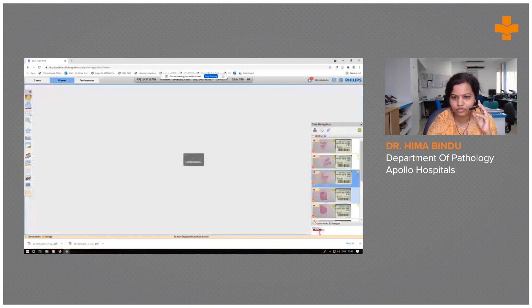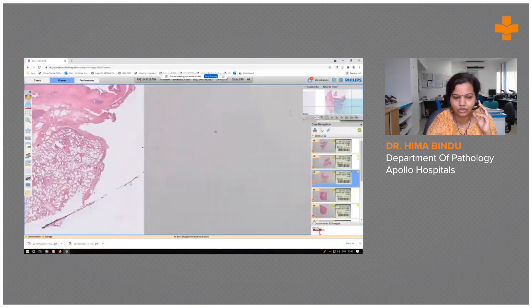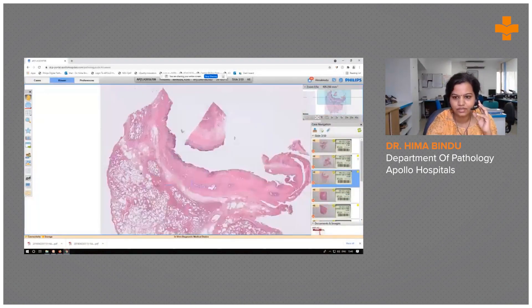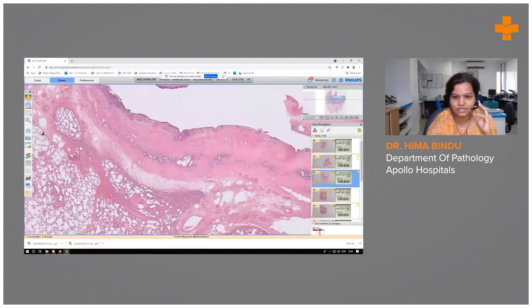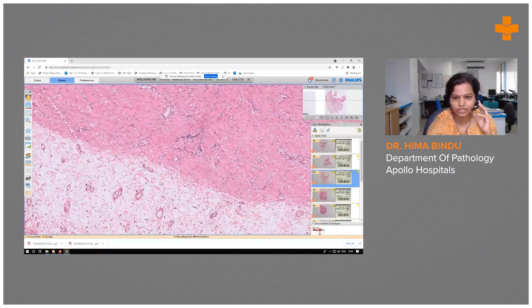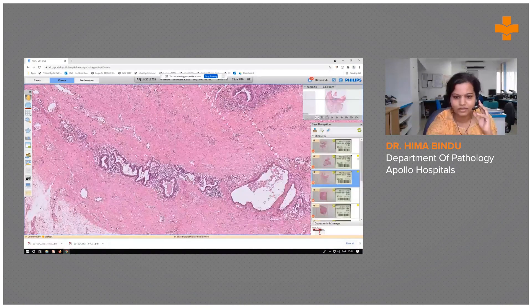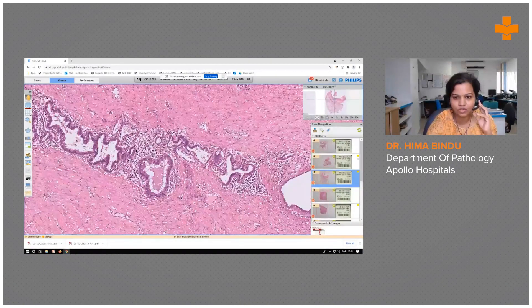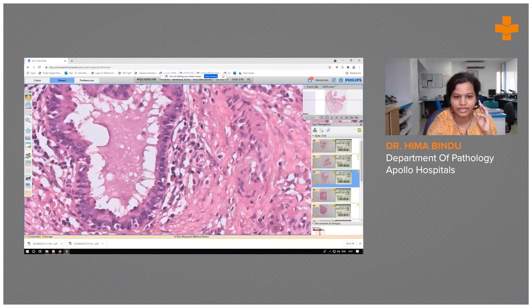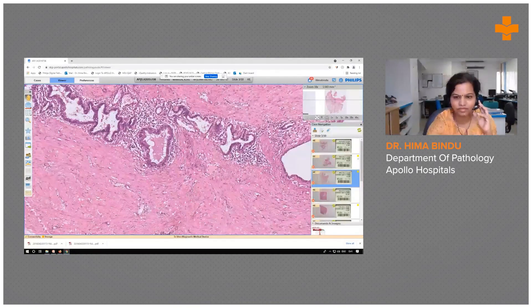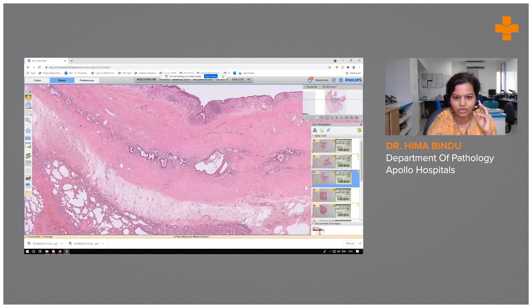Other foci of the cyst showed a smaller cyst within the cyst wall, which gives us a clue to the diagnosis. This smallest cyst in the cyst wall has a similar lining epithelium surrounded by mild inflammation within a dense fibrocollagenous cyst wall.